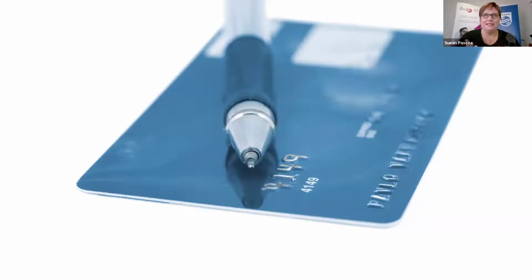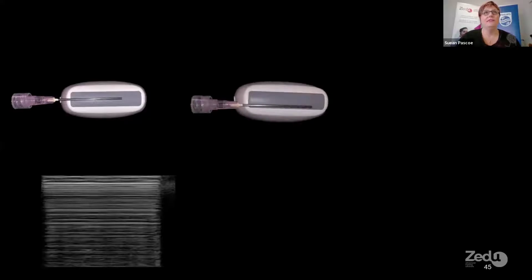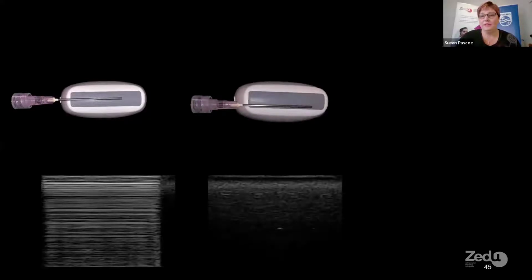And to be able to see the needle the whole way along, you've got to thread your needle along the length of this credit card the whole way along. So if we look at a needle on the end of the probe, when it's right in the middle, we see a good reflection. I can be just off center a little bit and I'll get absolutely nothing. In real tissue, if you're off just a little bit, sometimes you'll see a little bit of movement of the tissue planes as your needle comes in. But if you are off axis, you won't see the needle at all.